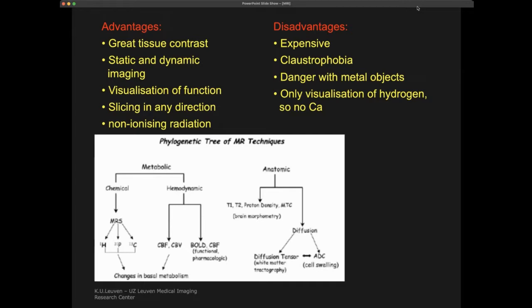But mostly with adults, especially older patients with implants, you would go for a CT instead of an MRI. But sometimes it really depends on what the information is, whether it is crucial to make a diagnosis or decision, and then you would take the risk, yes or no. But in general, radiologists try to avoid getting patients with implants into the scanner.